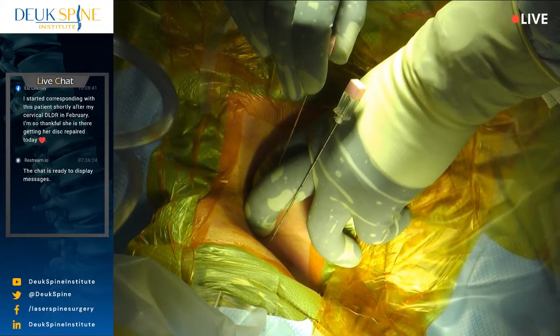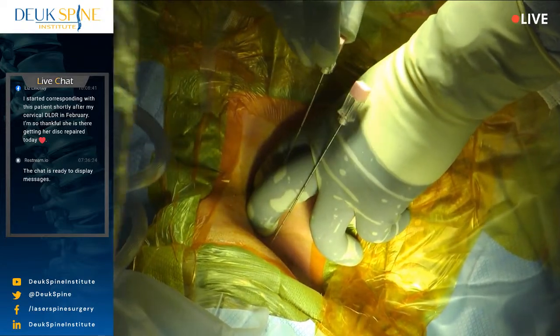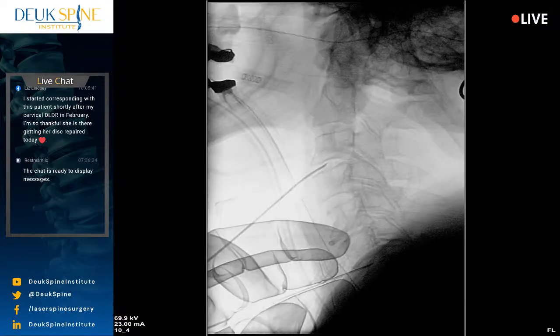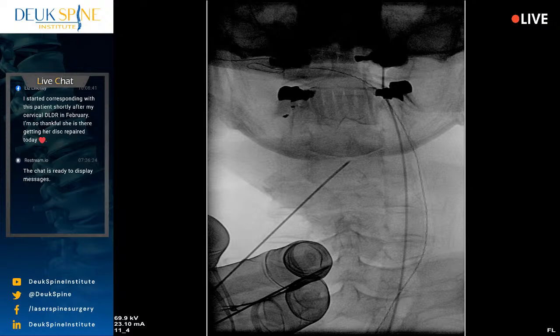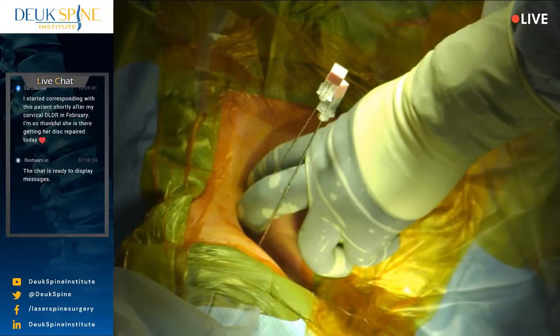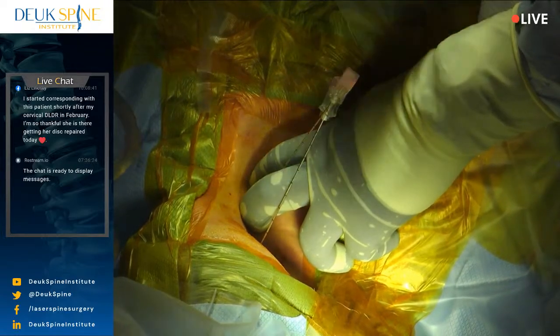Let's get an AP. Again, you got to get me a good AP. I think I'm off to the side. Yeah, I am. Shot. That's better. Lateral quickly. I need you to pull just slightly out down here on the shoulder. That's it right there? Yes, sir.